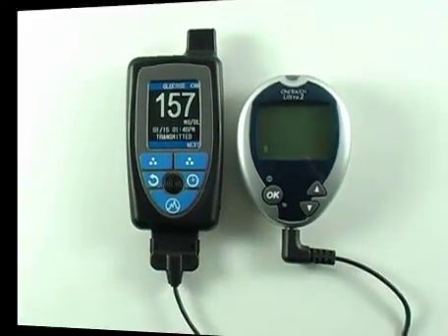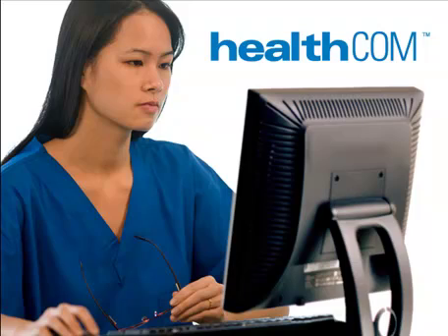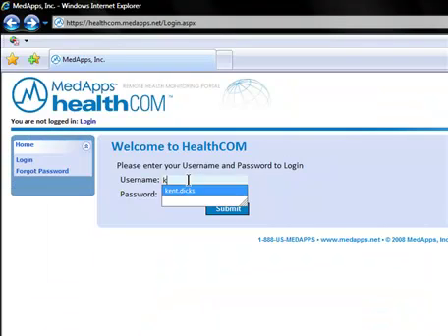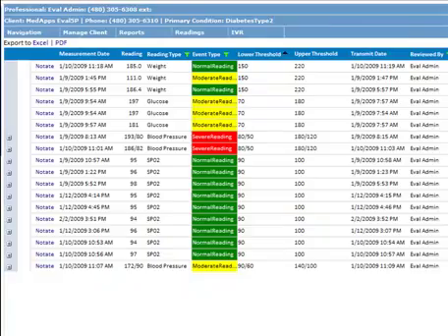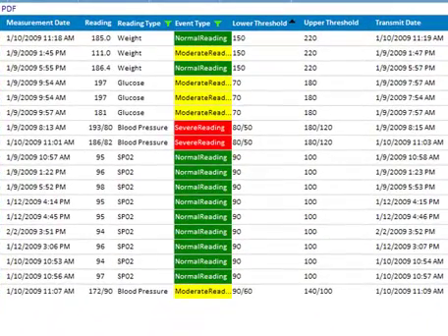The second part of the MedApps mobile wireless system is HealthCom. HealthCom is a web-based portal which allows healthcare providers to monitor biometric readings from their patients in near real time, from anywhere they have an internet connection. HealthCom displays patient information in a quick and easy to read, color coded format.